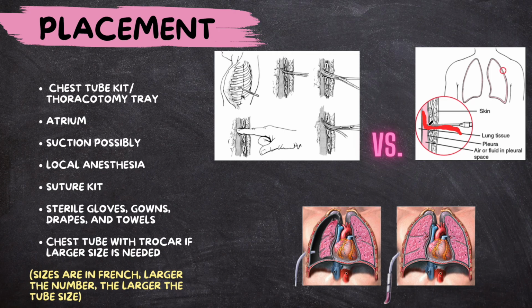So you'll slide your wire out last once it's all said and done, and then the provider will go in and suture that tube into place. So that way it doesn't move or pull out, hopefully. So this is for your small tubes, right? We're going to write small across the top just to help remember. Now look here. These can be your large tubes.